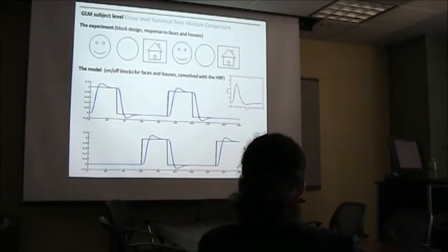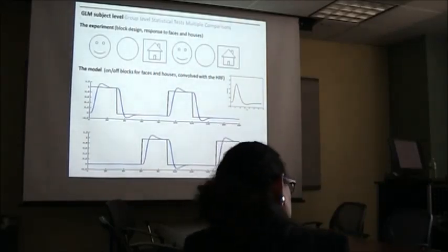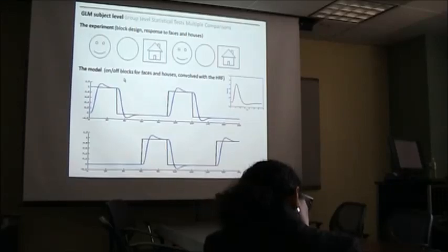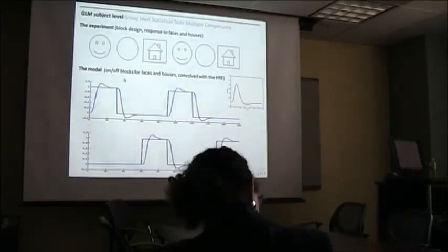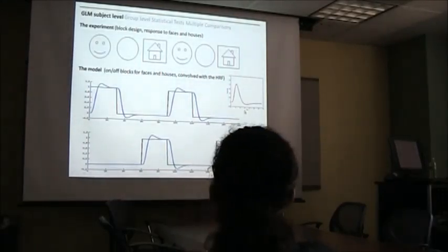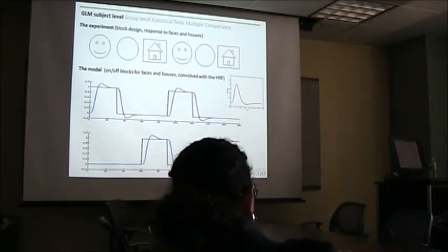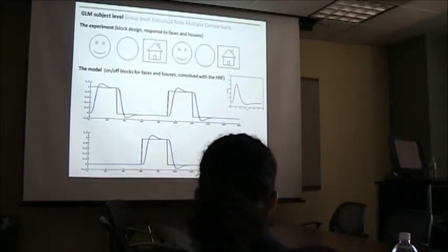If you start working towards event-related designs, where we have a lot more stimuli and a lot more different conditions presented a lot faster, making sure that you convolve the onset times with your hemodynamic response function becomes much more important. Because if you wouldn't do that, then your model would be completely off, right? But SPM does that, yeah.